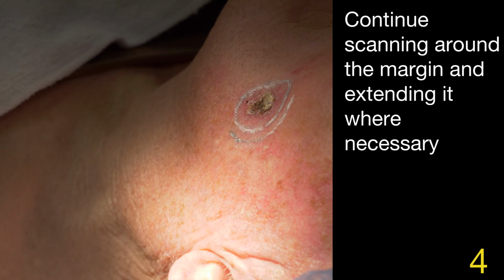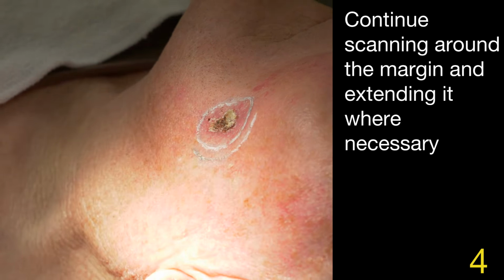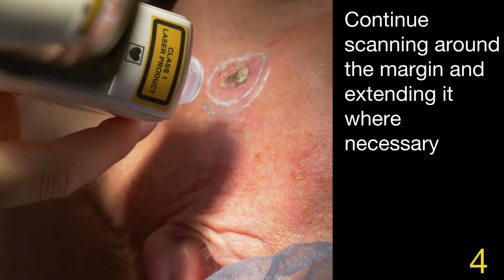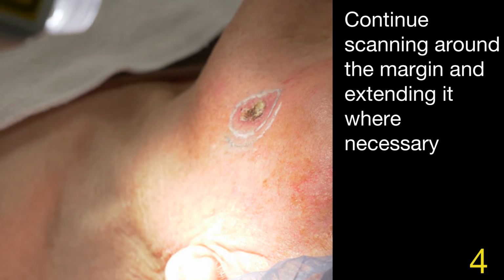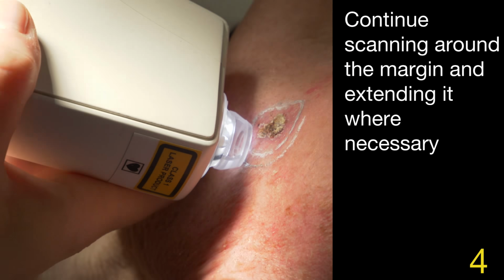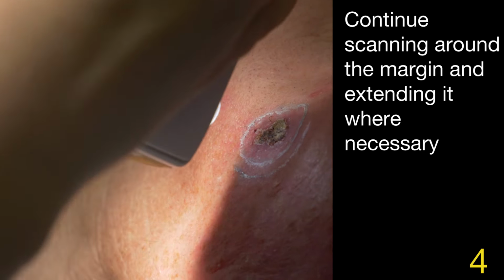On to 6 o'clock. Okay. So for the 3 o'clock margin, you've corrected it again. Yes, I've corrected it again. We can also check if it's okay now. But normally I do it clock around and then I start again. Because there I still see some more tumor. Okay, then we need to position it like this.